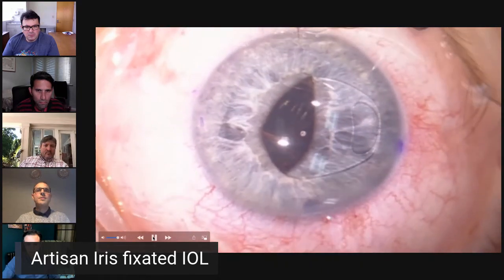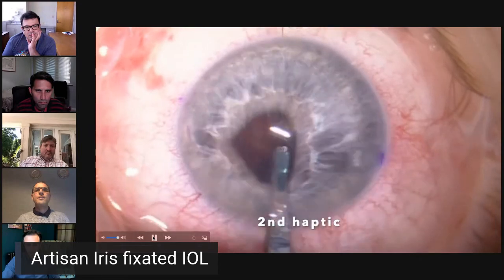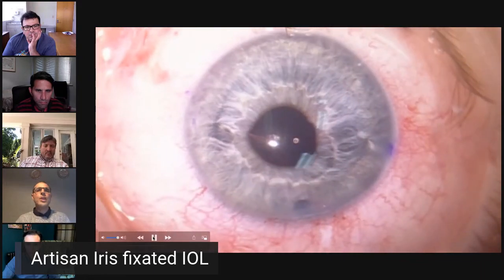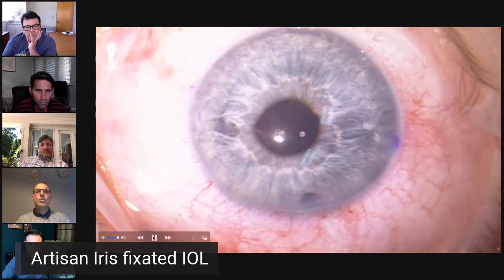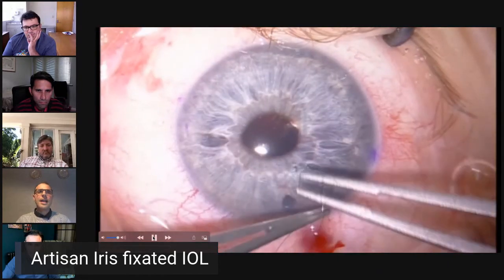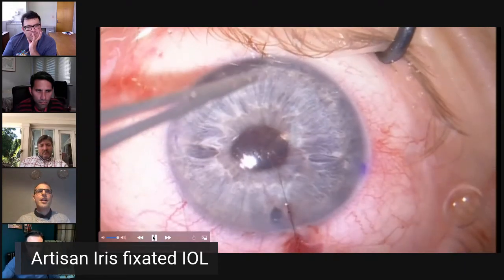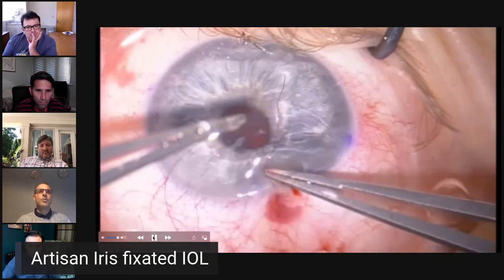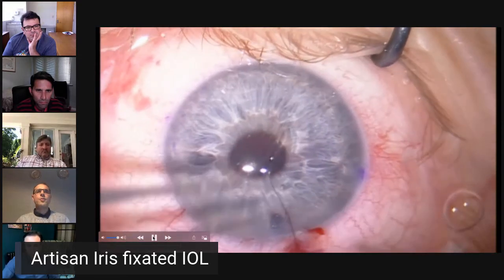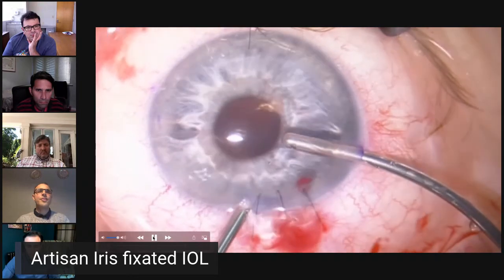So now I'm holding the lens with my left hand and push it gently behind the iris. Once it's behind the iris, with the lacrimal cannula, through the other paracentesis, I tuck it and I make sure I get a good tuck. This is usually about a 5.5 to 6 millimeter incision. So usually I spend some time closing that incision with about 2 or 3 sutures. And I try to make the sutures gentle just to avoid any astigmatism. As you can see, this option is very nice. It takes just 10, 15 minutes maximum to sort this lens in place to conclude the surgery. And one good tip also is to be very gentle when you do the final irrigation aspiration at the end. Just very gentle with the IA.